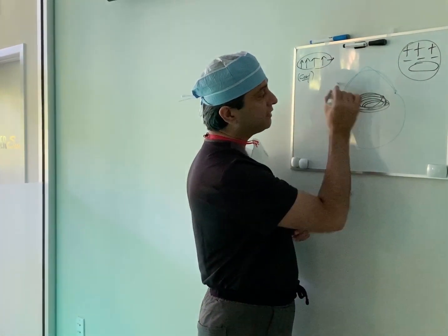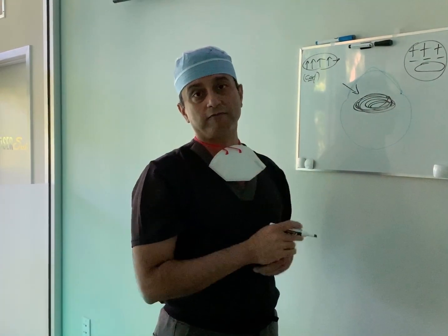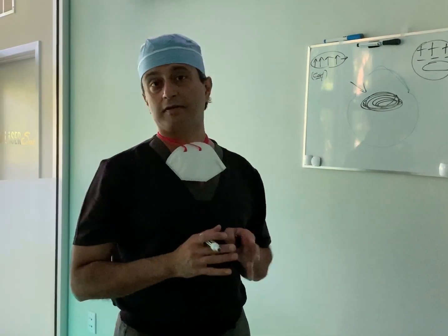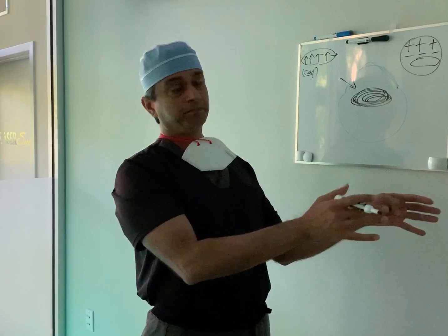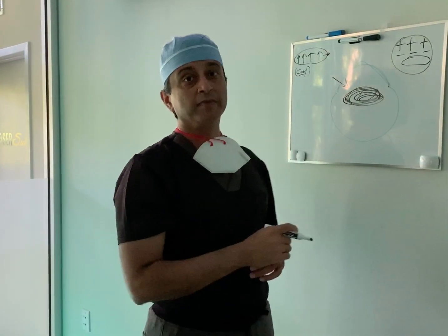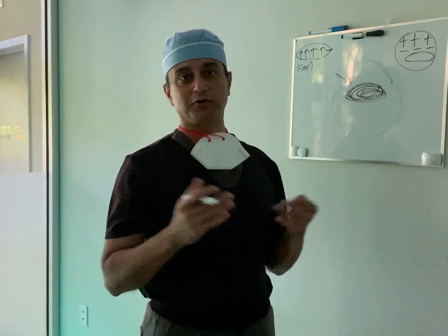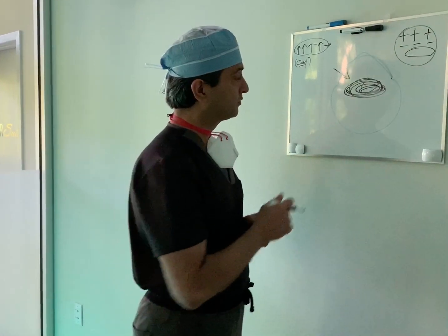Technique wise, what I like to do is always keep your rhexis small, around 5 or less than 5 millimeters. Because toric lenses, I've never had to rotate a single one in 2 decades. You want it fixed during surgery to stay that way. Alright, second, you also want the rhexis to be large enough in case you need to flip the entire cataract into your anterior chamber, which is deep enough so you do the surgery quickly, efficiently, and most of these cataracts are soft when they present.